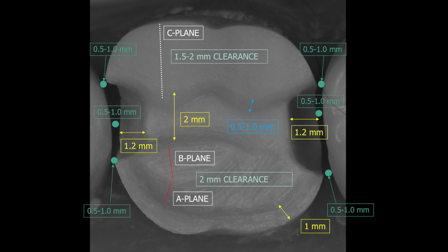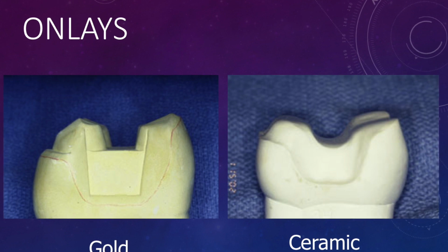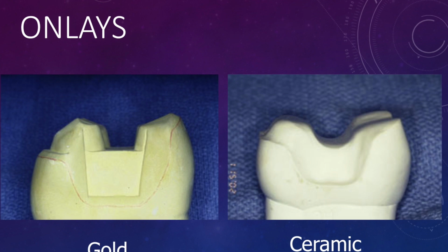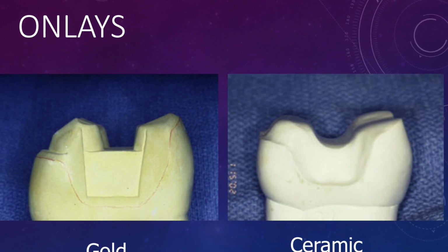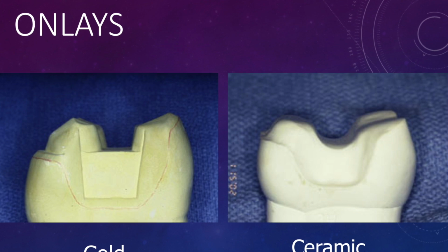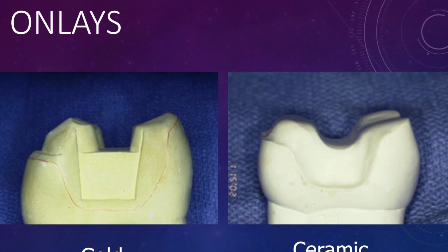It has a shoulder on the functional cusp, and the occlusal clearance is approximately 1.5 to 2 millimeters. Let's also remember that gold onlays and ceramic onlays are incredibly different. When you look at the diagram on the left, and this is a photo of a model that we use for teaching purposes, you can see the line angles are very sharp. All of the external features flow very smoothly, but the internal features are very sharp. Transitions between inclines and walls are crisp and well defined. This is required for maximal retention for gold restorations.